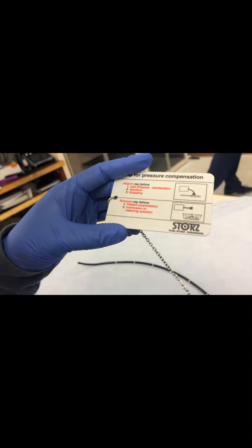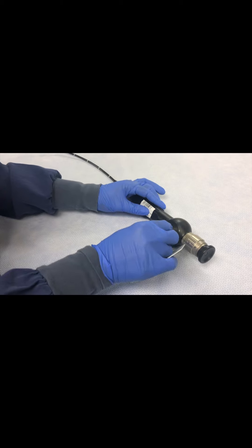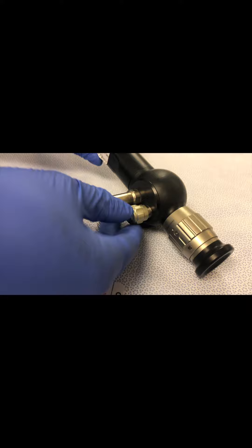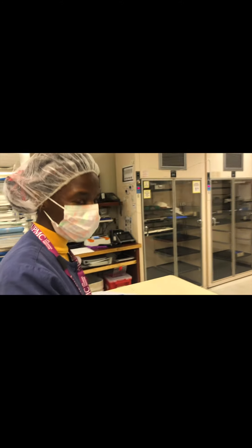I have to put it in so that pressure doesn't build up here and blow up the scope. So it goes here like this. Now it's ready — I can put it in the case and then it can be sterilized.